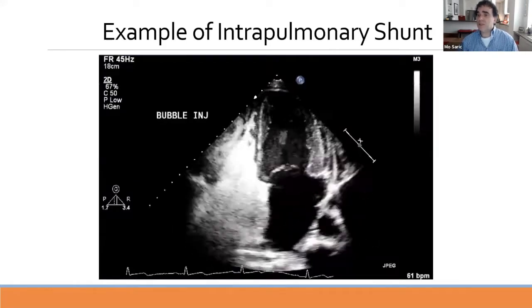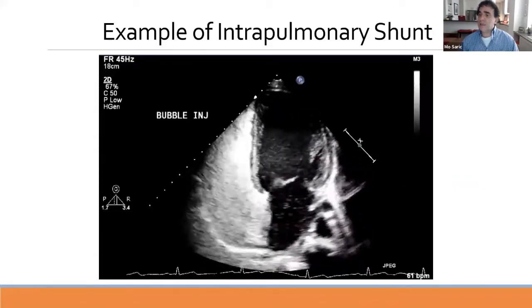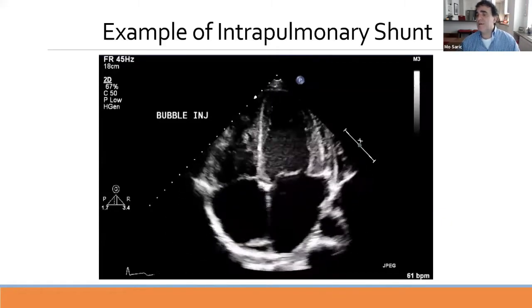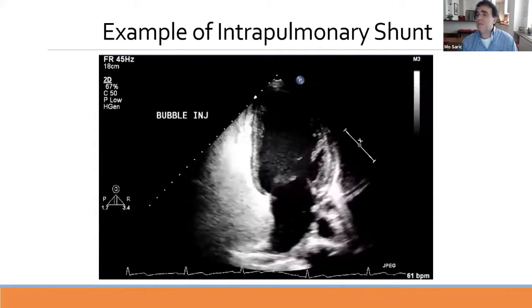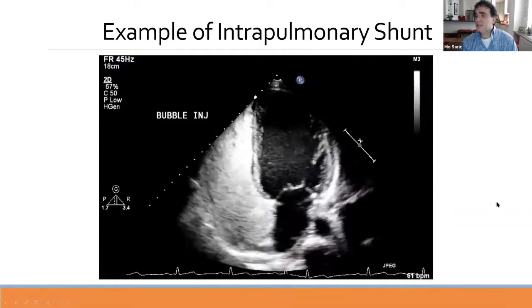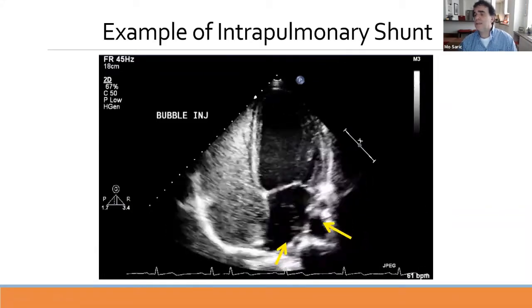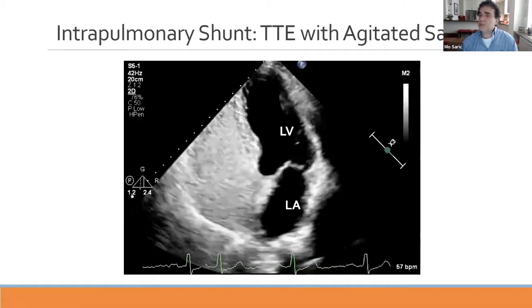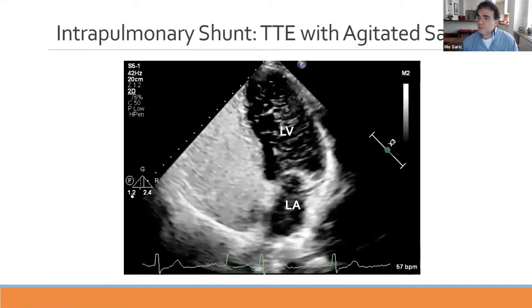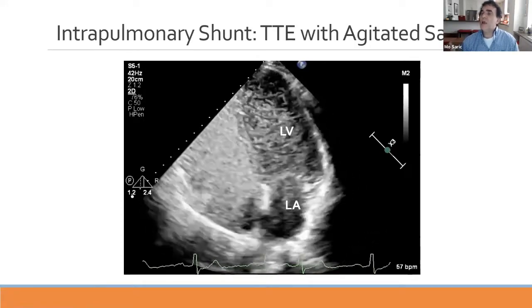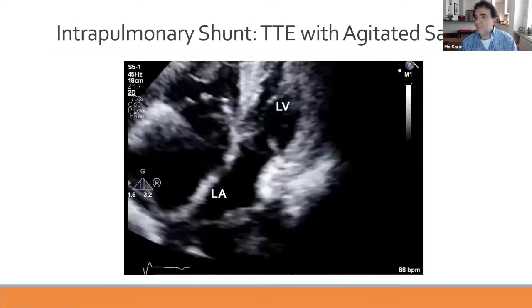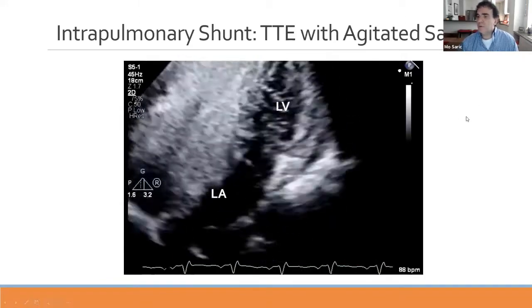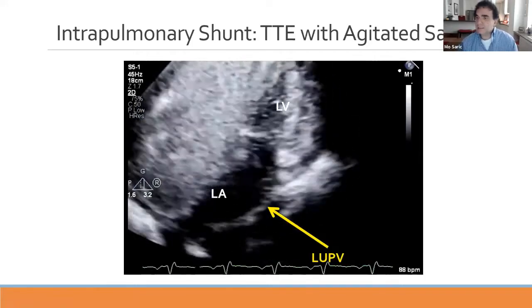For comparison, this is a bubble injection in a patient with true intrapulmonary shunt. There is a very delayed bubble appearance, but once the bubbles arrive, there is a continuous, steady increase in bubble volume—not the bolus pattern seen in PFO. Clearly here, the bubbles arrive from the pulmonary veins rather than across the interatrial septum, confirming the intrapulmonary shunt.